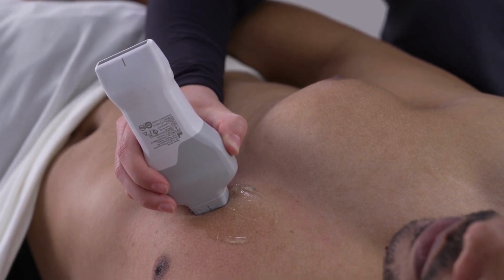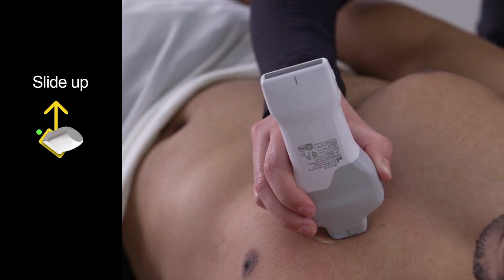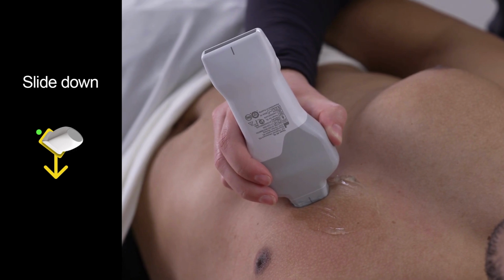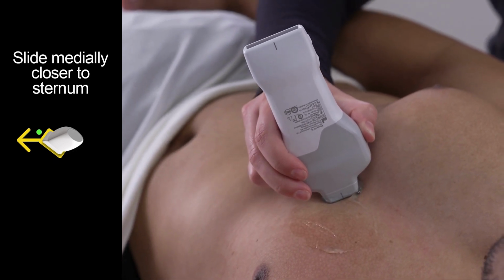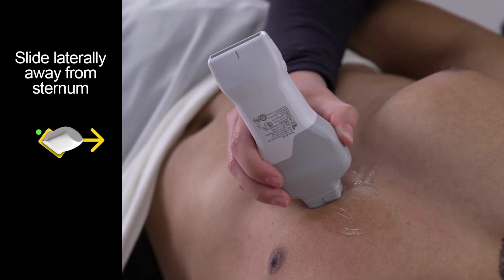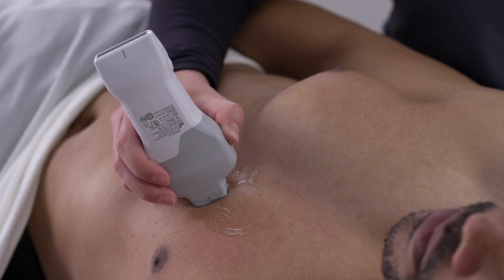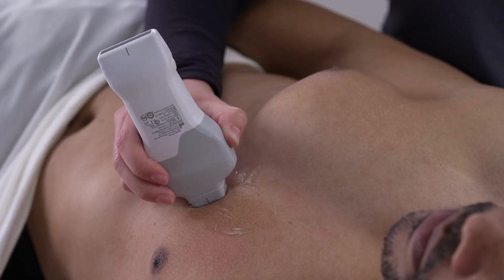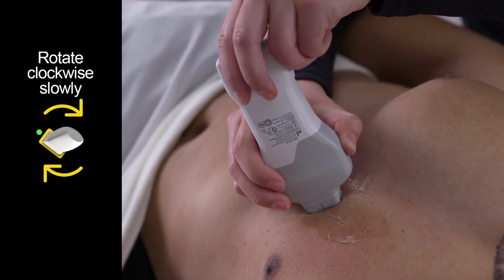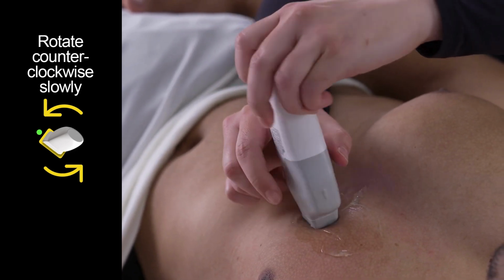For all other movements, you want your wrist secure against the patient to prevent any accidental probe movement or slipping. Sliding guidance is also used for smaller movements, such as sliding up towards the patient's head, sliding down towards the patient's feet, sliding medial towards the patient's midline or sternum, and sliding lateral towards the patient's left side. Rotate is another guidance prompt. Since it is a fine movement, make sure to stabilize your wrist and hold the probe close to its face for maximum control. The 2 directions for rotating are clockwise or to the right, and counterclockwise to the left.